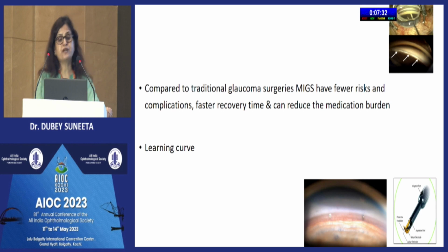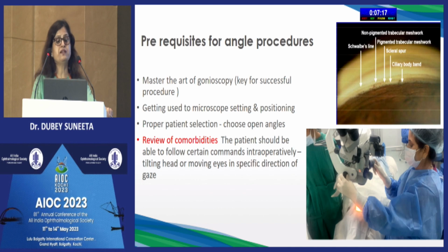Compared to traditional glaucoma surgeries, MIGS have fewer risks and complications and faster recovery time. They can reduce the medical burden and therefore improve the quality of life. However, they definitely have a steep learning curve. So one should be very well aware of the prerequisites of angle procedures before starting. And most importantly, one should master the art of gonioscopy, which is key to a successful procedure.